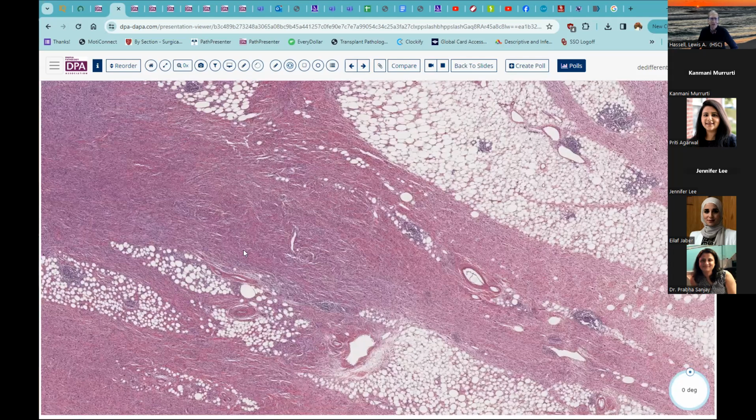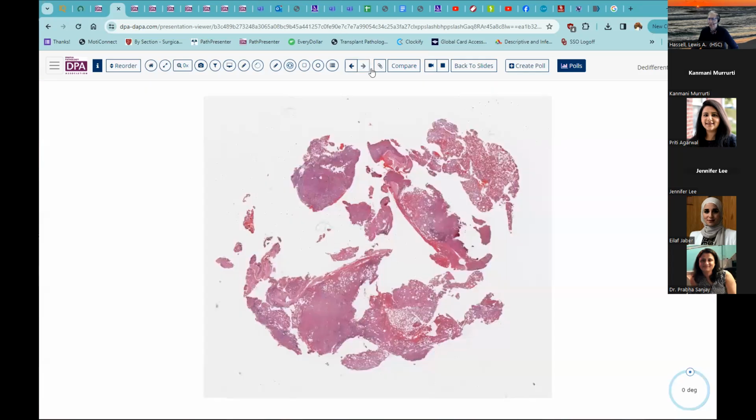And that's not so much the fat itself that's growing as opposed to the mesenchymal neoplasm that's growing amid the fat. So thank you for that very good question. That's very, I think, very helpful to think about it in that way as well. I think that's all I have on this. Oh, no, that's not a liposarcoma.